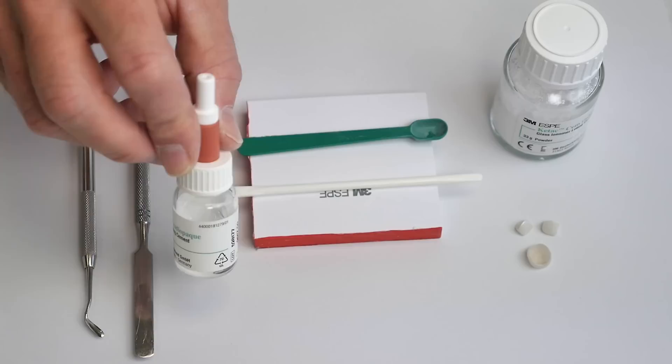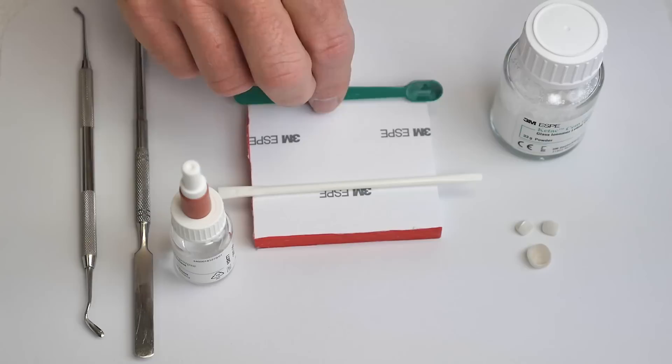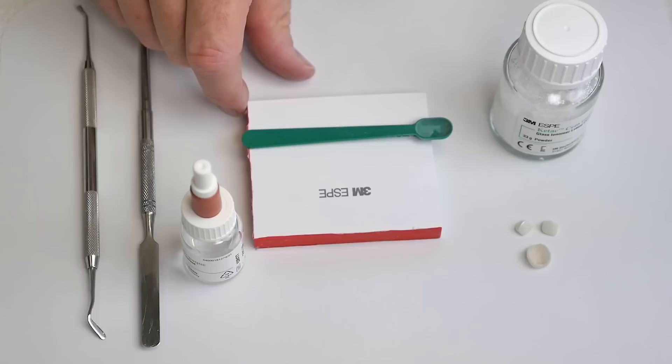First, we have the powder. Second, the liquid in its handy dropper bottle. Third, we have the measuring scooper. Fourth, we have the spatula. The spatula that comes with the kit — this plastic spatula — is not very good, so I'd recommend getting rid of it completely. Instead, get yourself a metal spatula; it is much more effective at mixing cement. And lastly, we have the disposable mixing pad.